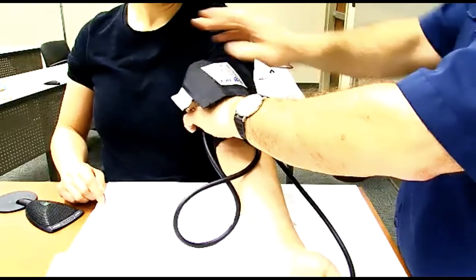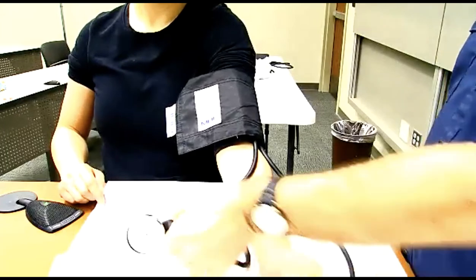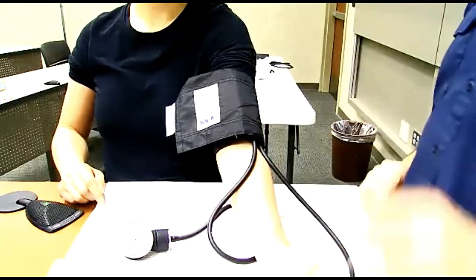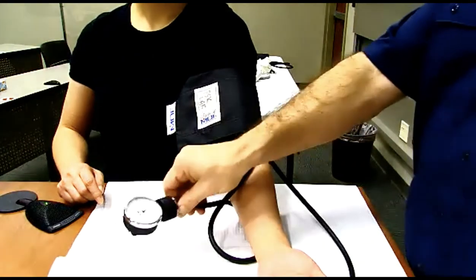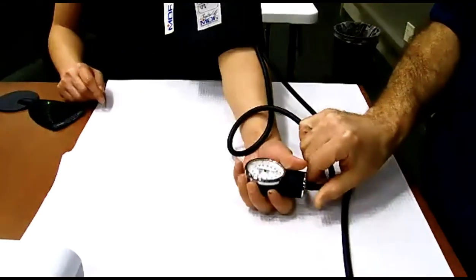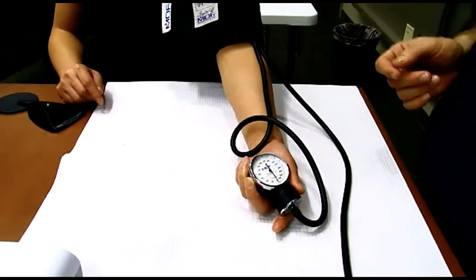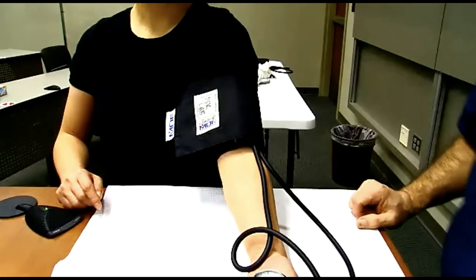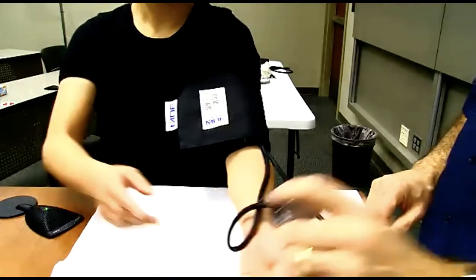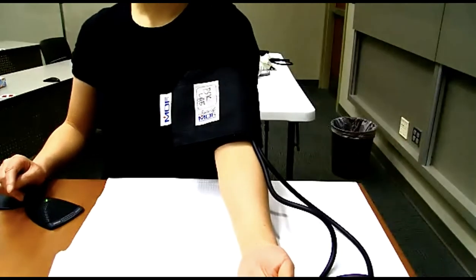We're fine on the test. To be honest with you, what most people do on the test is not to use that notch and either just press it on the counter where you can see it. So again, I know you can't see it, so I can press it there where you can see it. Or have your patient say, can you hold that pressure gauge for me? Can you hold that? And so just have your patient hold it so that you can see. Okay. So there you have it. So now we're ready to go. But I'm not going to have my patient hold it for now. I've just put the cuff on. That was step three. What is step four?